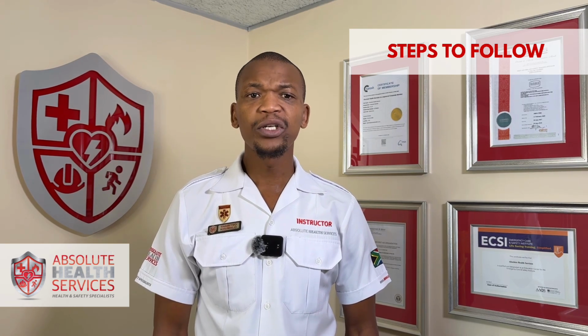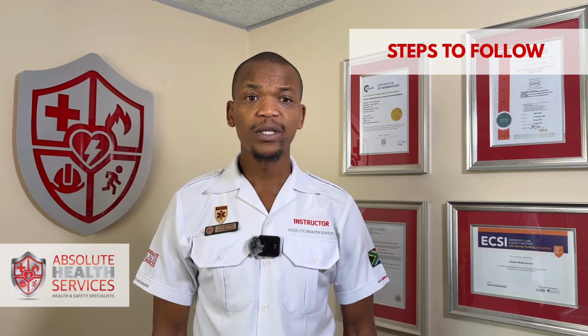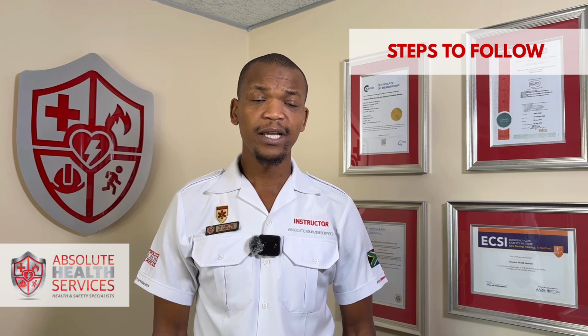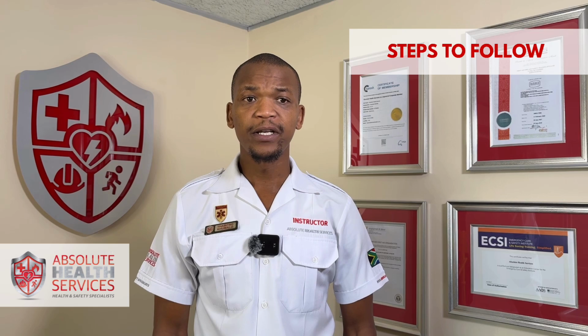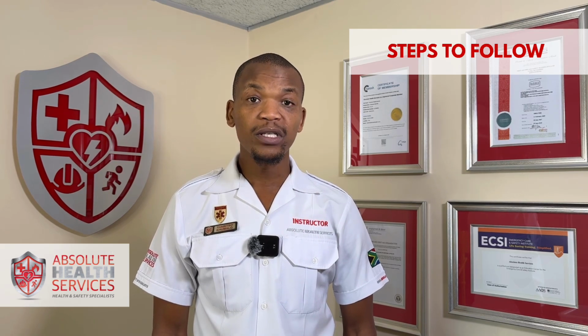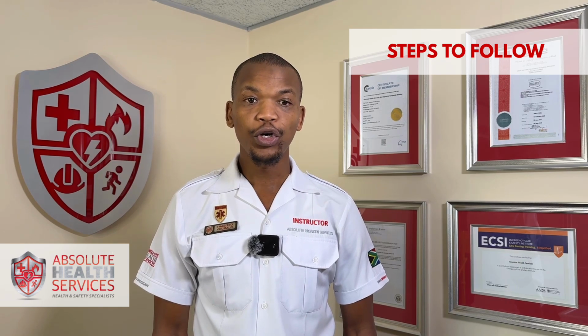No pulse, no breathing. You request somebody to bring an AED and call an ambulance. You will then start with your CPR by performing 30 compressions, followed by 2 ventilations, and you repeat this for 5 cycles. While you are waiting for an AED, whenever the AED arrives, remember not to stop with the CPR, but allow the second rescuer to switch it on and follow the voice prompts.